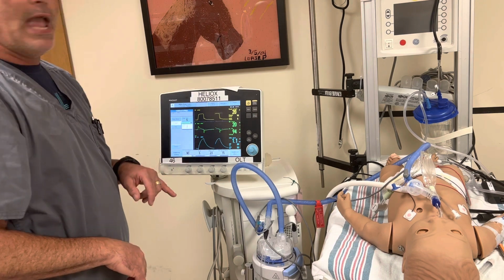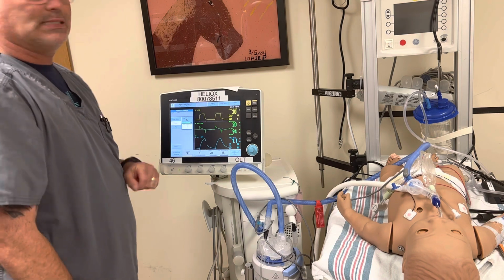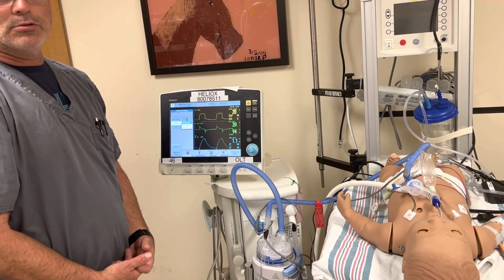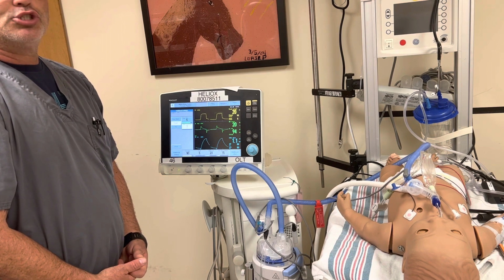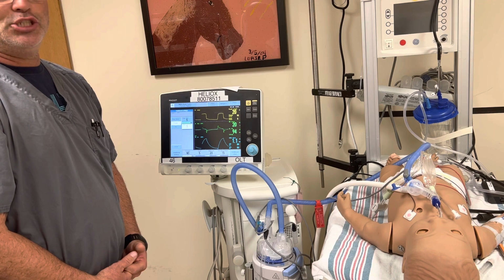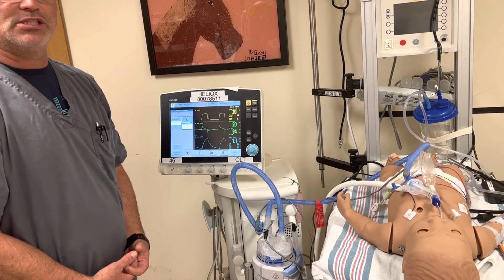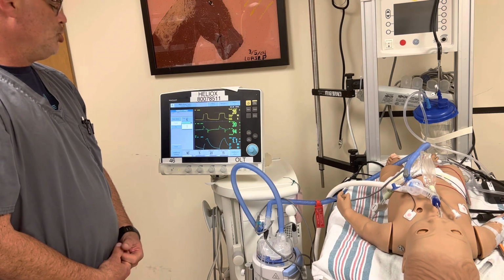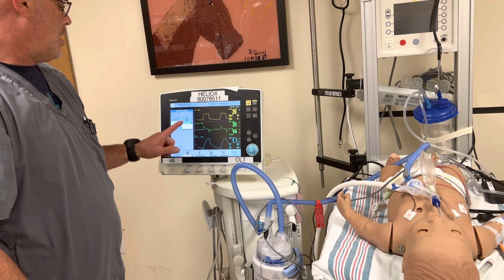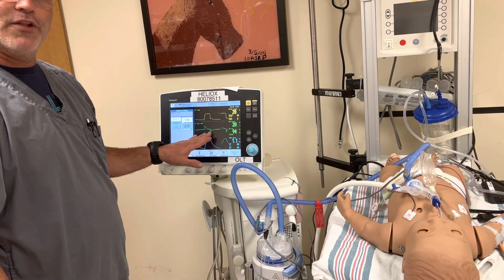Now, the last thing we have here on this mode I'm showing you is the percent cycle. What the percent cycle does is it cycles the pressure support breath only, and it cycles it based on a flow termination. So what we're doing is we're setting this at 1% on all our patients from the get-go. And what we're doing here is basically mimicking our zero flow policy on the I time that we just talked about, how we set our I time to get to zero flow on the waveform.